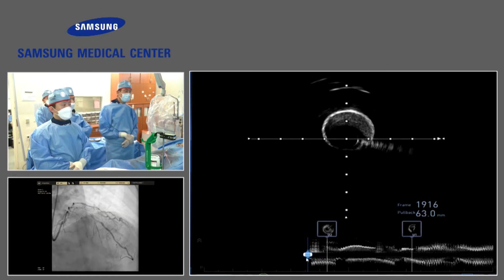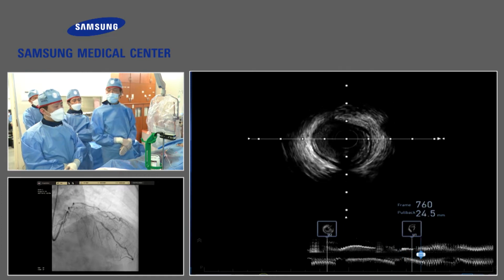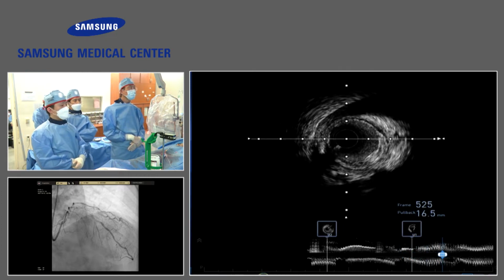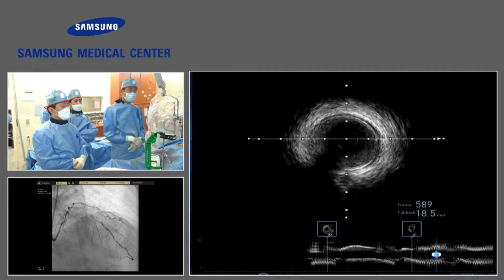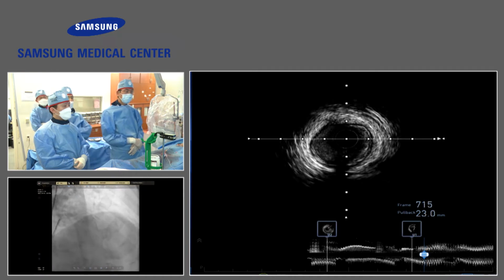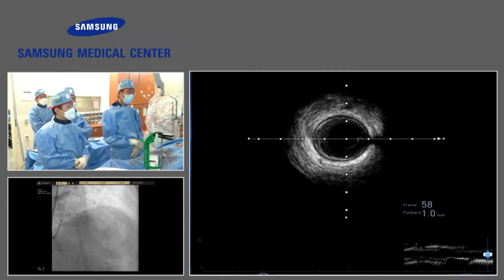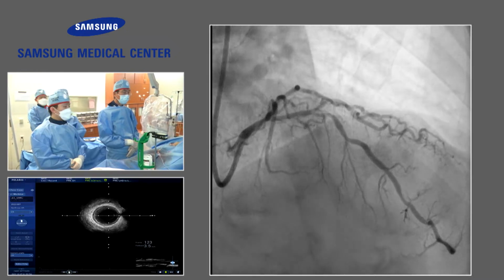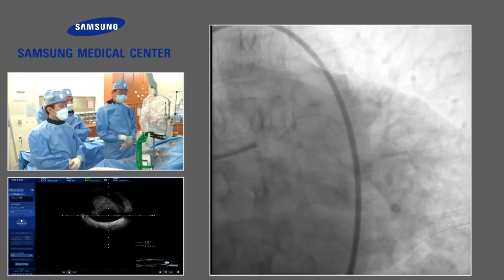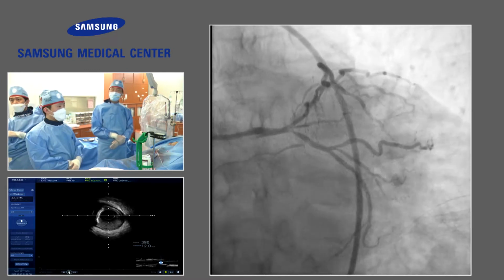It's quite different, IVUS compared to angiography. So we need to follow the vessel size dependent approach. Intravascular images give us a lot of the information. Circumflex. When we look at the angiogram, as I comment, the left main size looks like smaller or comparable to mid-LAD, but with intravascular imaging, the left main lumen size is quite spared.